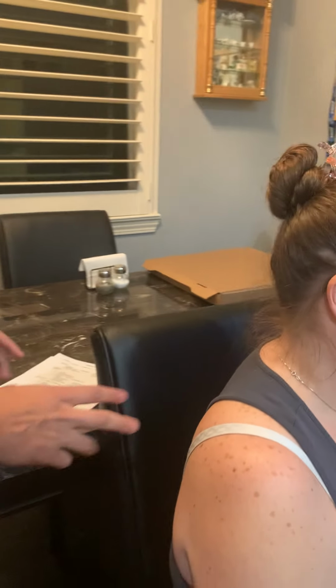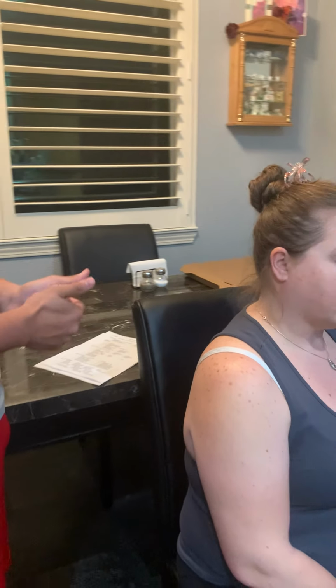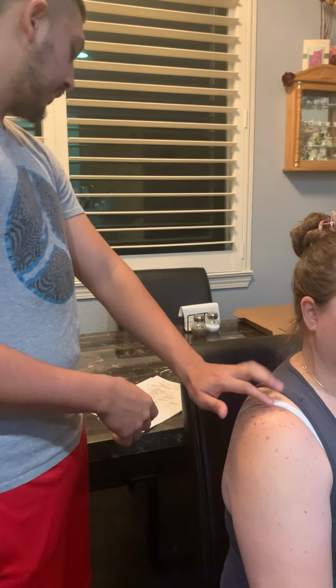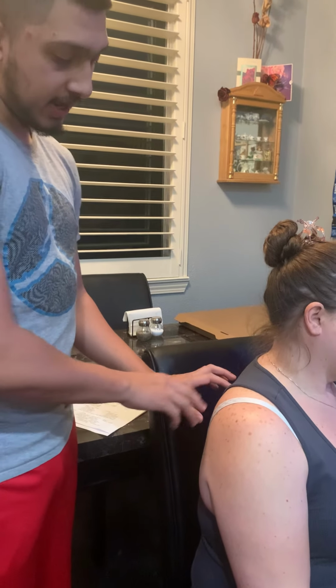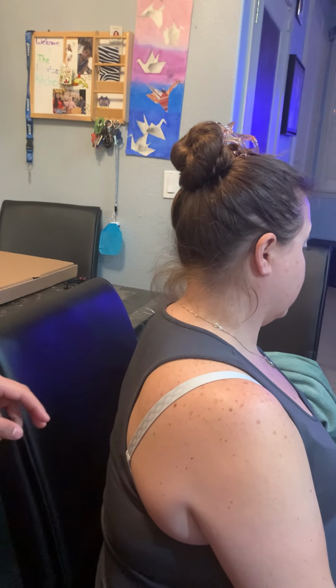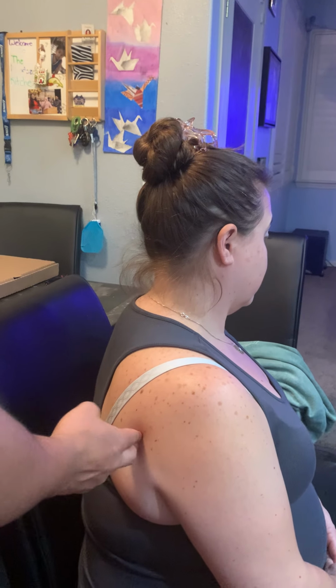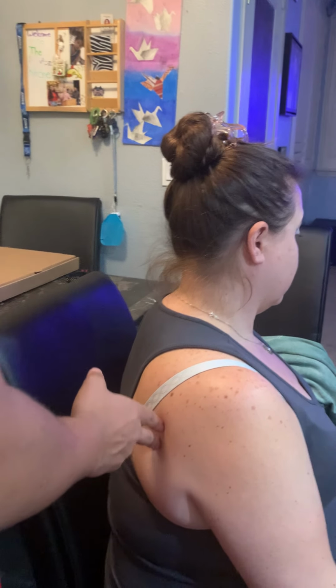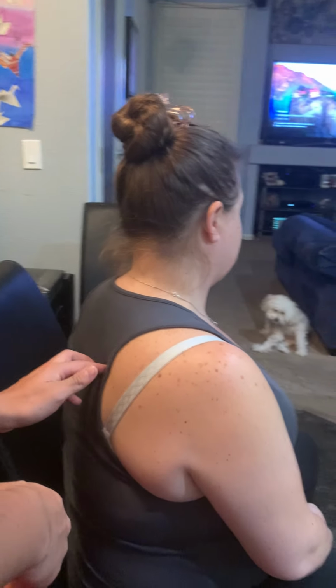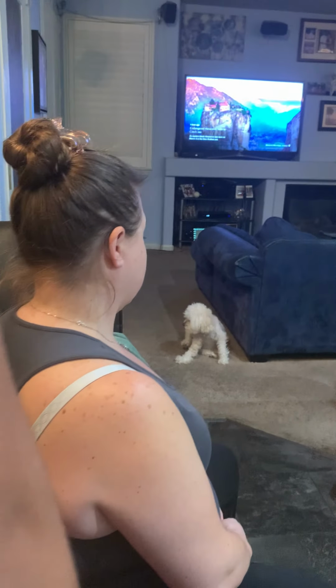And then we would take a look at the soft tissue, the rotator cuff muscles. We already identified the supraspinatus. The infraspinatus, which is just below it. The teres minor, which is here, below the infraspinatus. The subscapularis, which we can't really palpate because it's deep.